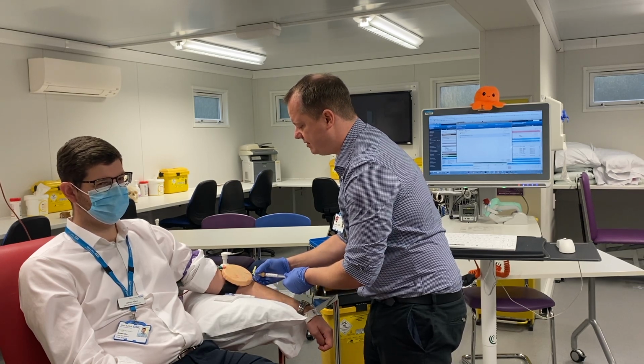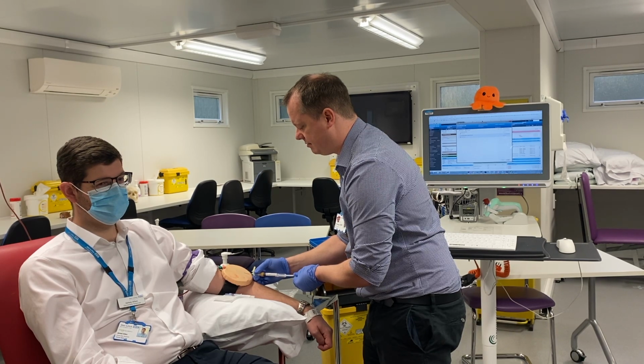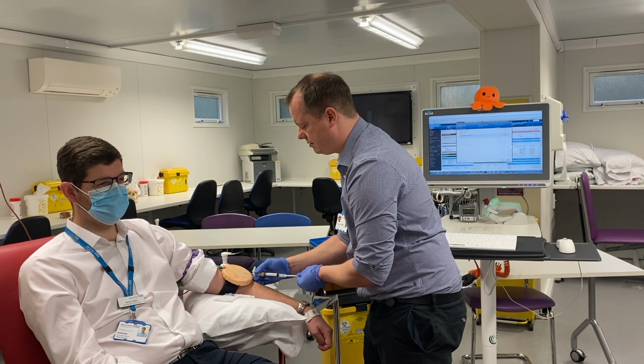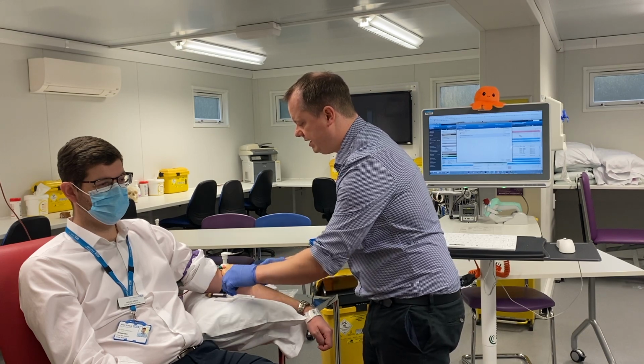And then I'm going to slowly aspirate the blood out of the vein, holding the needle very carefully. I'm going to put it nice and slowly and allow the bottle to fill, and then I'll twist the bottle, I'll take that off, and then I need to connect my next bottle.